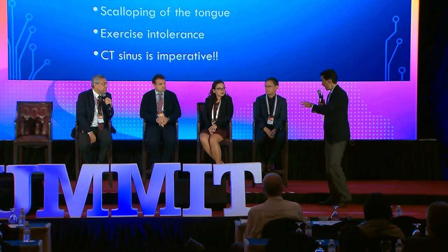Sure, because we should inform our colleagues not to have CT scan unnecessarily. So we only do cone beams on our kids. Yeah, that's all we use. Like you said, John has one in his office, so we use them for that purpose. But you're absolutely right about that. The radiation is very low.